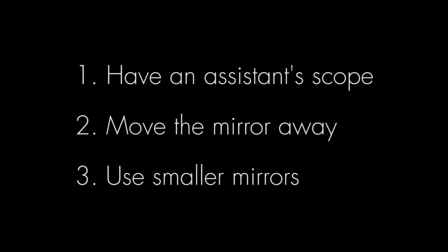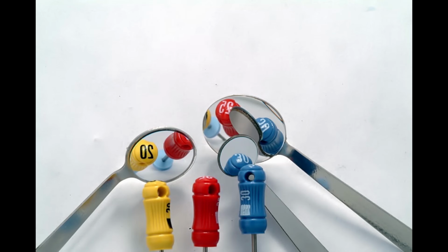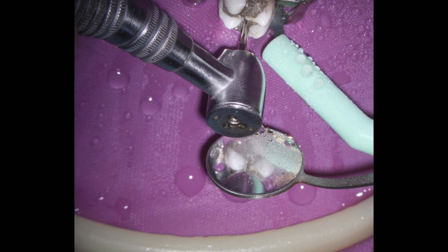I can show hundreds, but a few of the details to avoid having the assistant trapped are, of course, they need an assistant scope. You have to move the mirror away from the tooth much further than if you're just working normally. The use of smaller mirrors can also help, and larger mirrors as well, and moving the mirror away from the area that you're working or the way you're typically used to working.